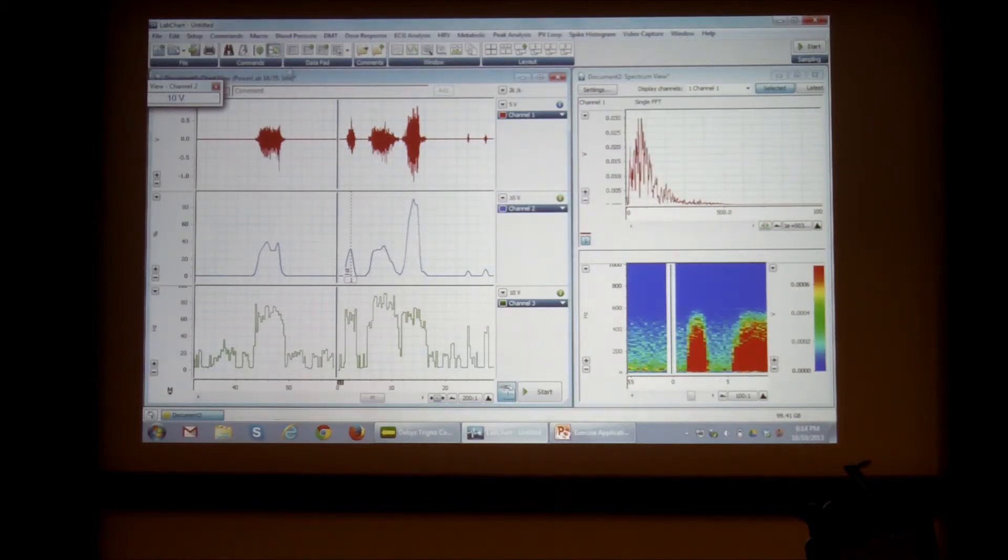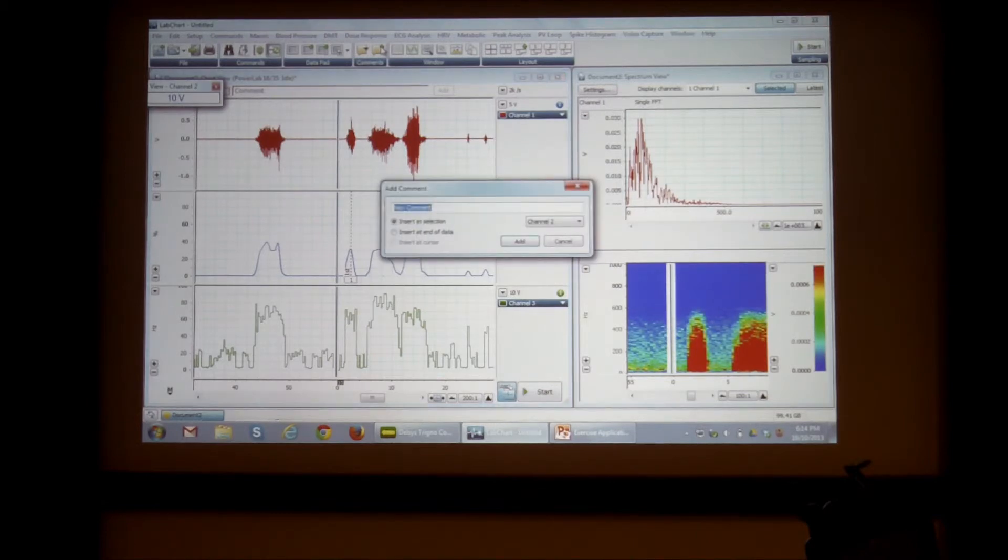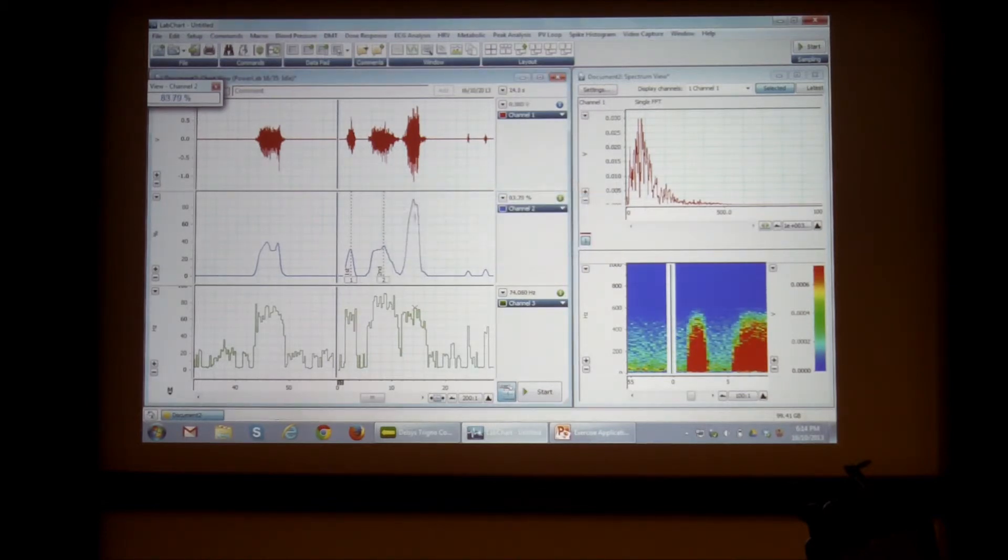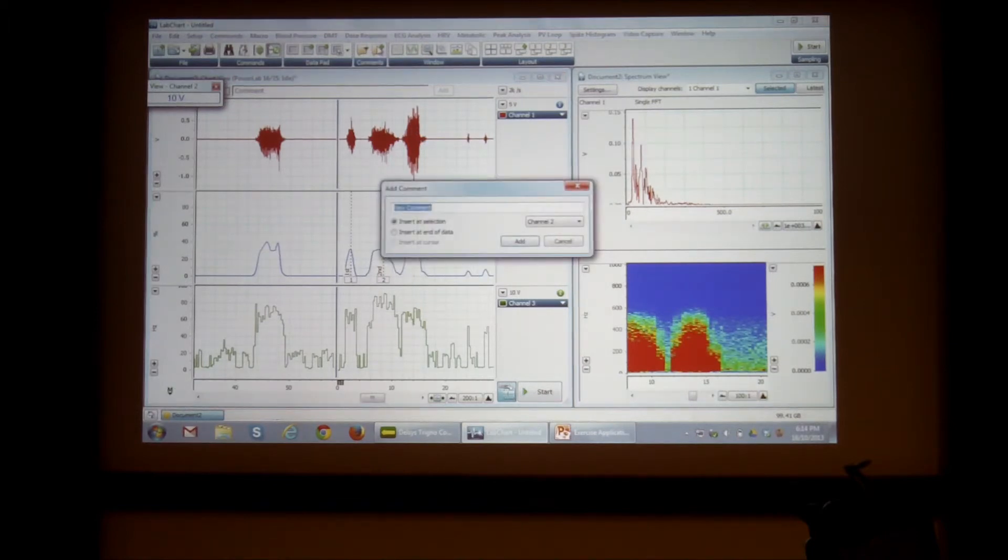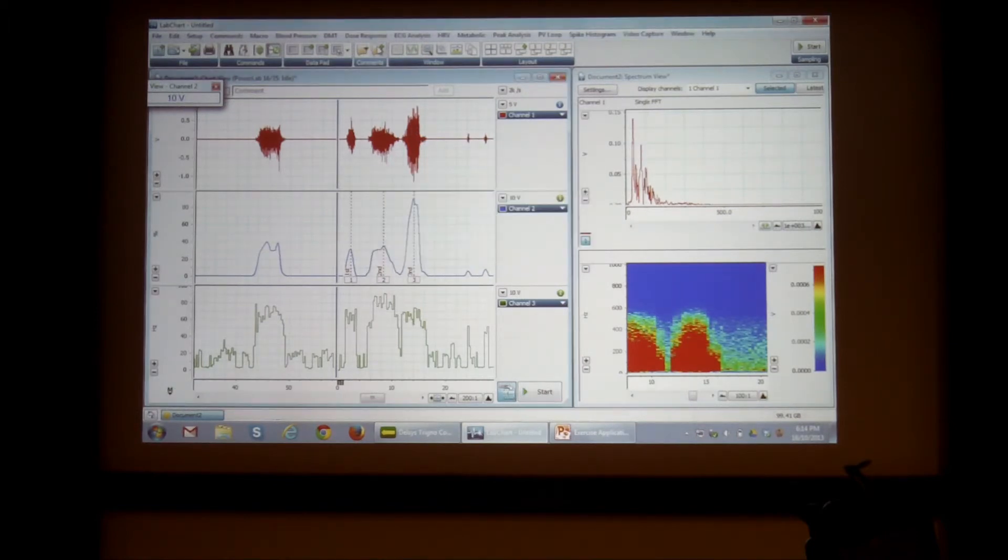Click here. Second. You can write whatever you want on these comments. And here I'm just going to add third.